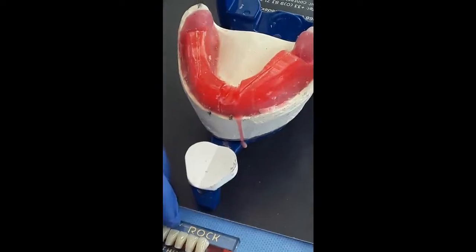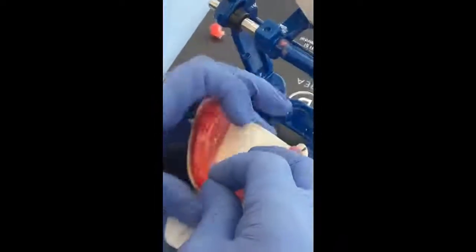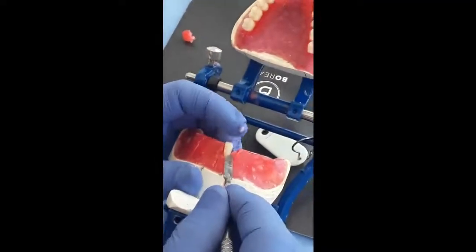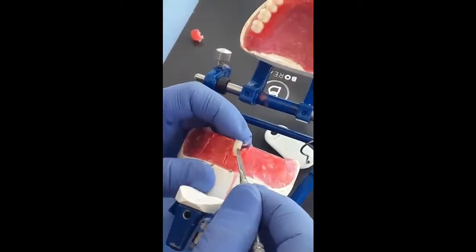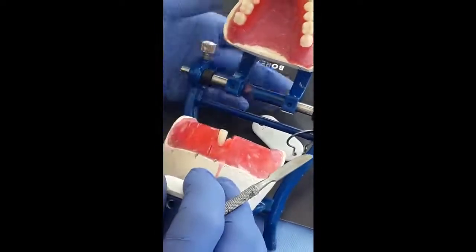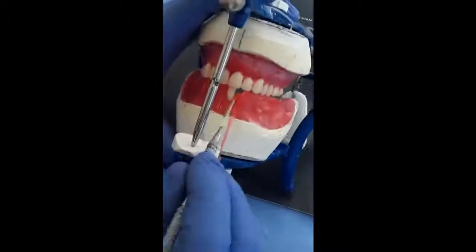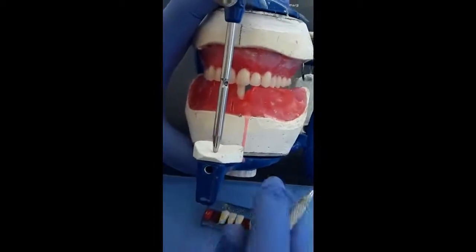Here we'll take the left lower central incisor and place it in position so it is a little bit higher than the occlusal plane, as you can see, labially inclined, long axis is vertical, and here is the amount of overbite created by the setting. Now we close the articulator and check the midline to be coincident with the upper midline.